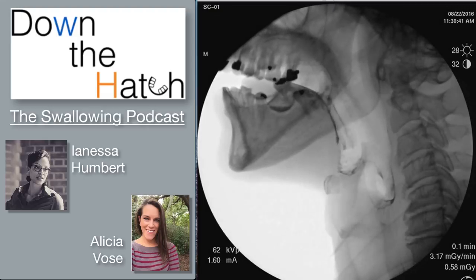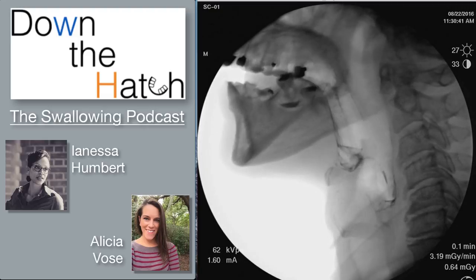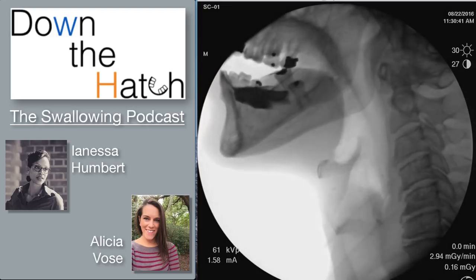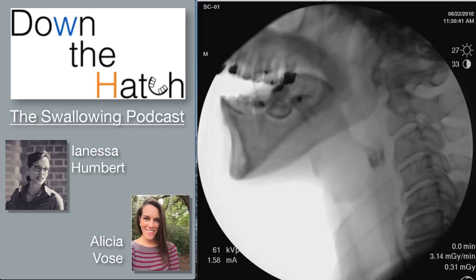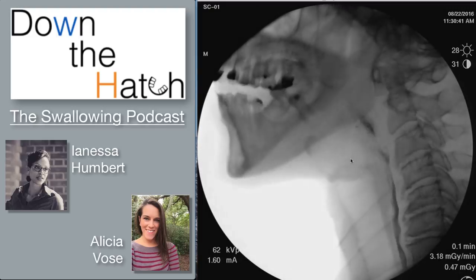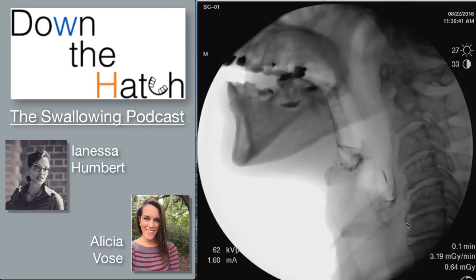When we think about bolus efficiency, we're thinking about the tongue, pharynx, UES, and velum. What stands out is the drainage in the back of the tongue after the swallow — the person feels it even though it's there and swallows appropriately. This person appears to have good enough sensation that feeling the bolus drain from the base of the tongue to the vallecula was sufficient to initiate a swallow that cleared the bolus.